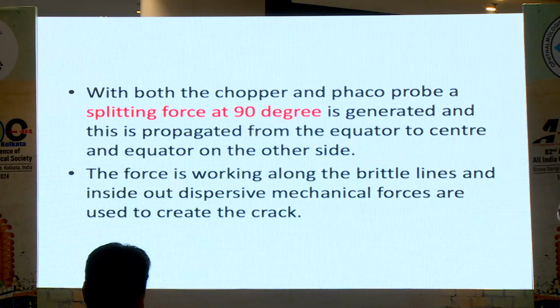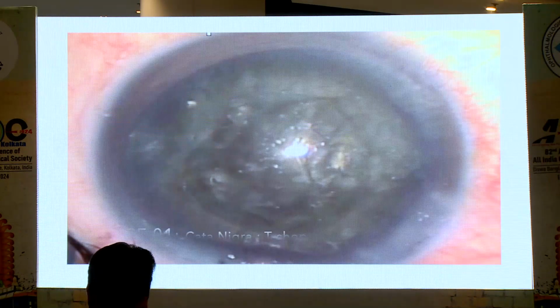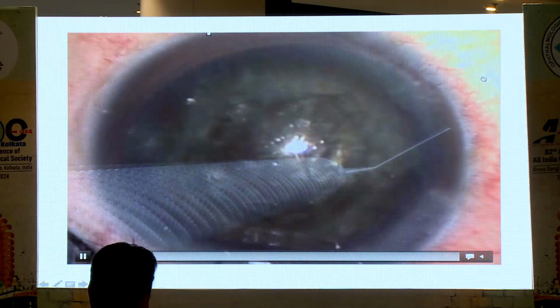The force is working along the brittle lines, and inside out dispersive mechanical forces are used to create the crack. This is how it is done. So it is only a superficial impalement, as you can see in this picture. Now I will show you some videos. So it's a cataracta nigra, as you can see.